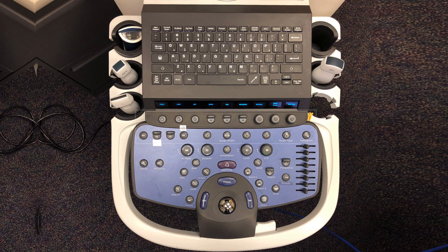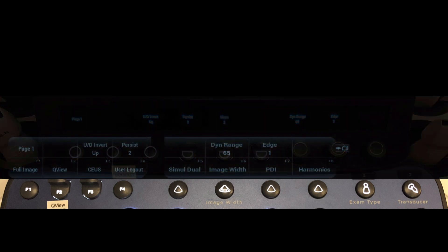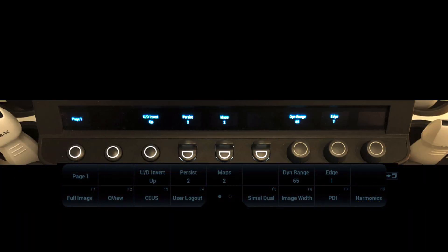Let's review using the system to scan and capture images, starting with menu and key functions. The OLED soft keys have a small OLED display that shows what the key does — this function changes with different presets. The function keys generally retain the same function in all presets. The bottom row of the menu indicators on the screen correspond to the function keys, noted as F1, F2, F3, etc. The top row of the menu indicators correspond to the OLED soft keys.